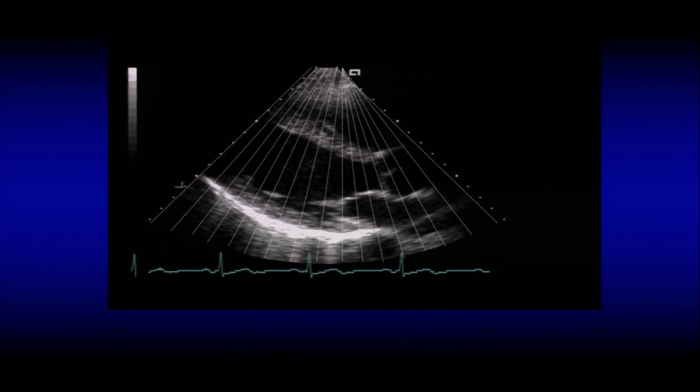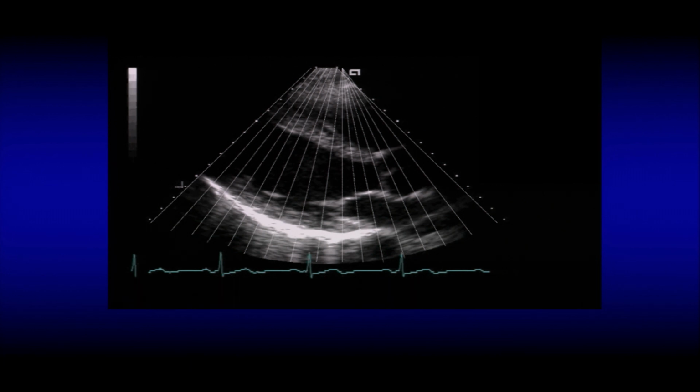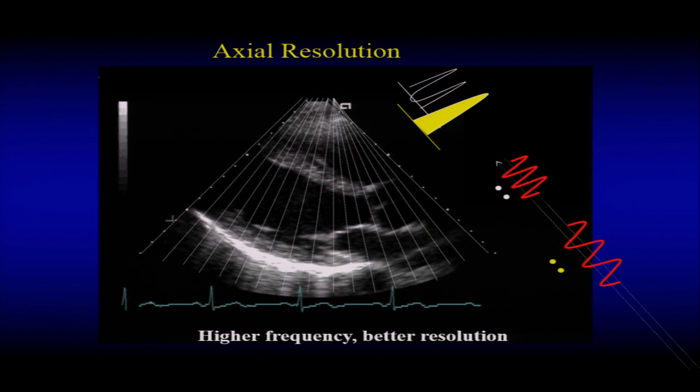And then I can put them in this scale depth, which is basically a scale of velocity and time, right? So that's how you put your depth together. So then I know if this is about 7 centimeters, it's going to take a little longer, as opposed to a 2 centimeter depth from there. The same principle applies if you're a fisherman in the sea looking under the water at fish. Whatever you locate with ultrasound, it's the same principle.